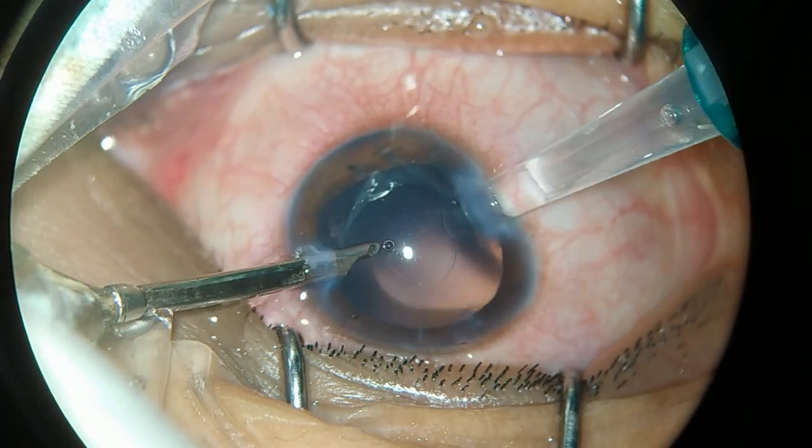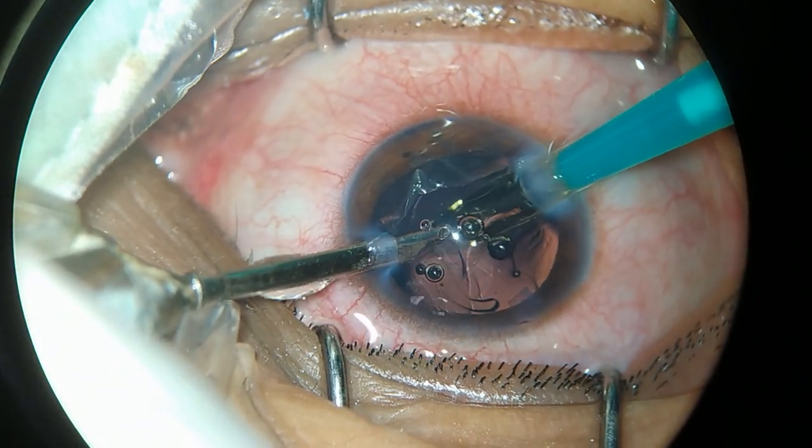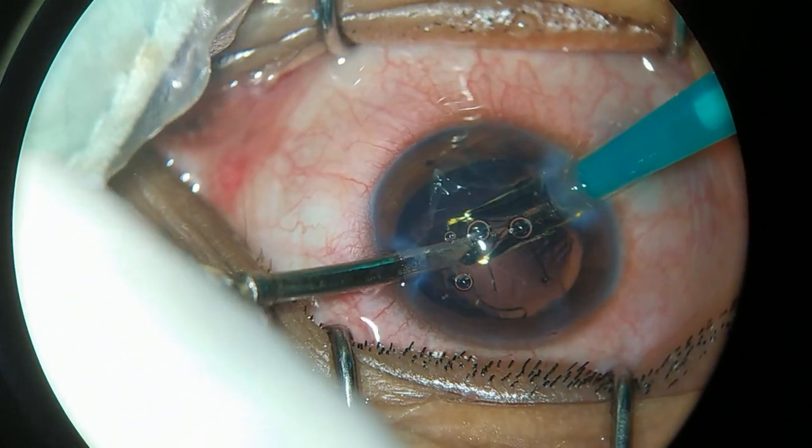After cortex wash, an extended depth of focus IOL is hydroimplanted into the bag.